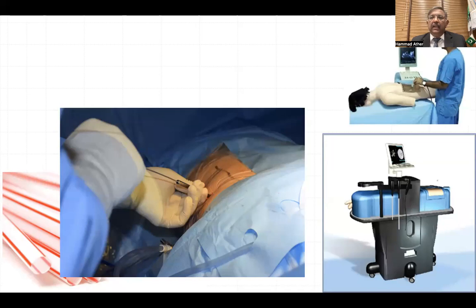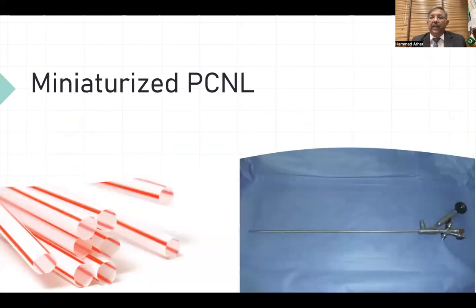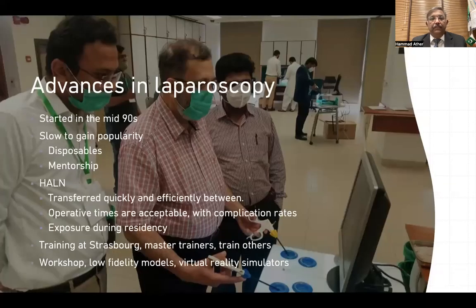Percutaneous nephrolithotomy, again, is the mainstay because the vast majority of our patients have a significantly large stone burden. The training and teaching of these has been important. Because of the introduction of mini, super mini and ultra mini PCNLs, although we didn't have access to all those kinds of scopes, and since the market is relatively small compared to India, I have used the McDonald's straw, properly sterilized, obviously, and the semi-rigid ureteroscopes to do mini PCNLs, and we've been very effective using laser.